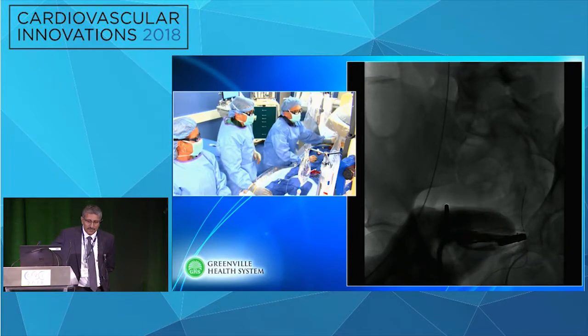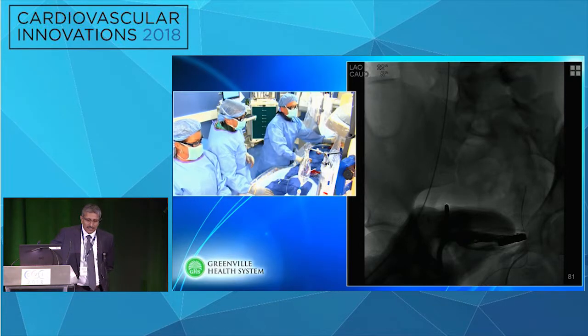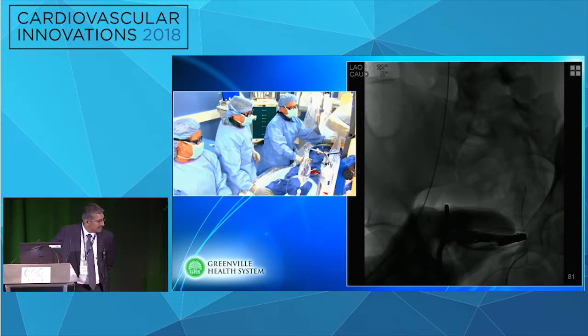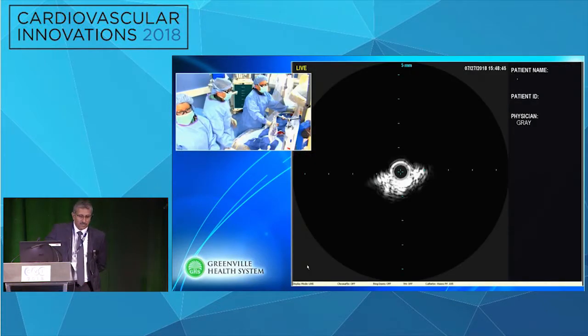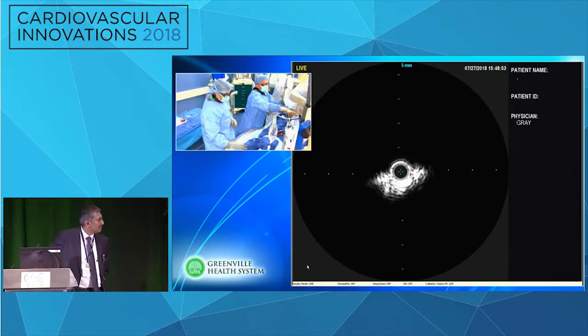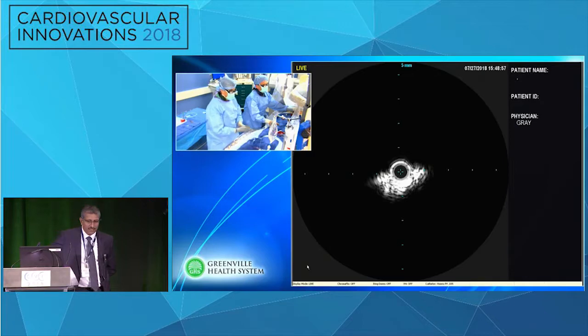Yeah, no questions. Can you show that? Phil, are you able to show our IVUS image right there? See the catheter going in the femoral vein there? We don't see it yet, but we are going to wait. But I think tracking it through some limited ultrasound might actually help. You can roll out this IVUS or the ultrasound for their camera if you'd like. You won't see much, Kenny? Not useful? Ken says it's not going to be very helpful here.